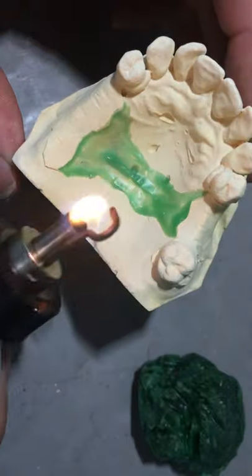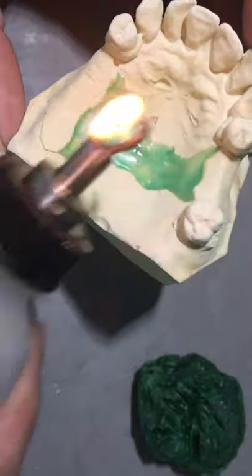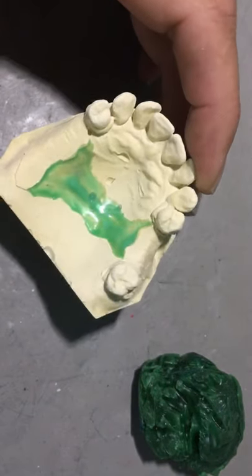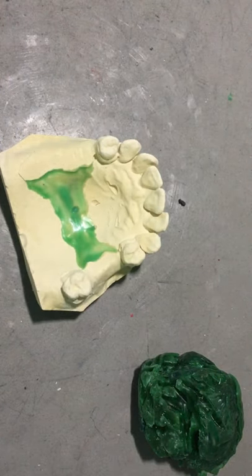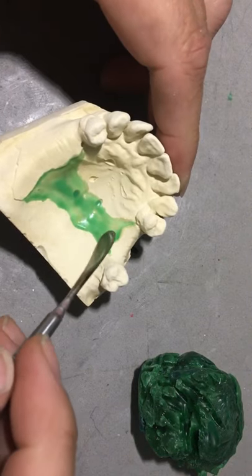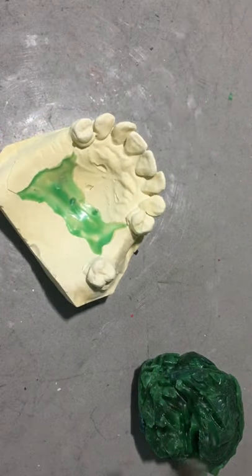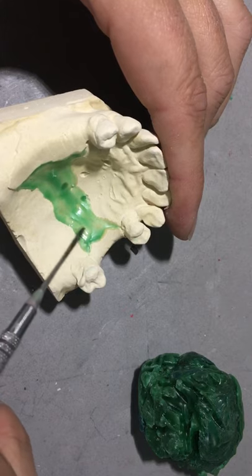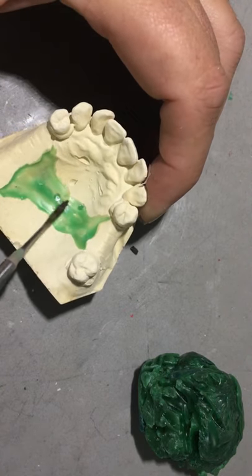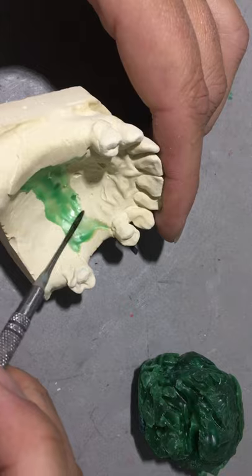I'll use the alcohol torch to smooth it out. You can see it's a little darker down the center. If it's a little thick in some areas you can thin it out. The wax up is at a stage where there's no need to rush. You can spend all the time you wish to carve the margins, highly detailed ones. Therefore less time is spent reducing the chromium cobalt when you're trimming.